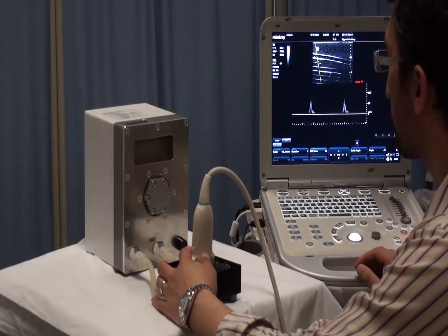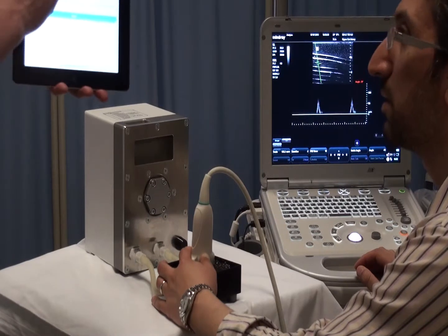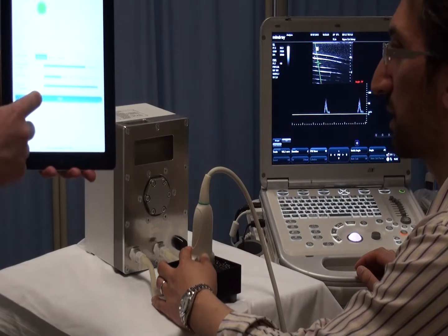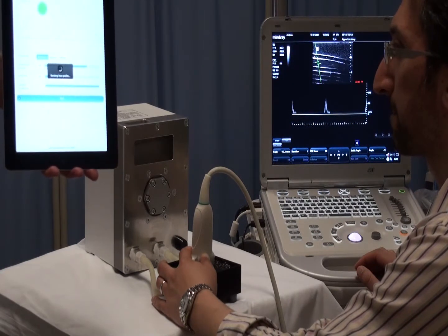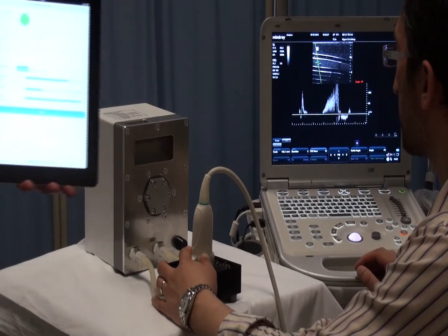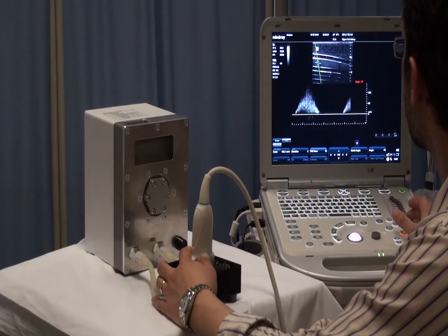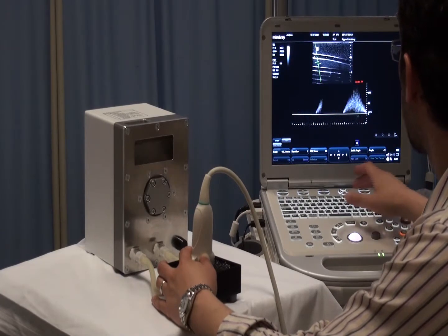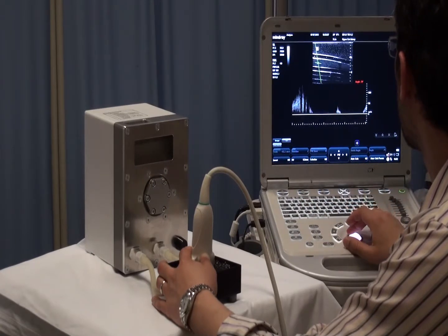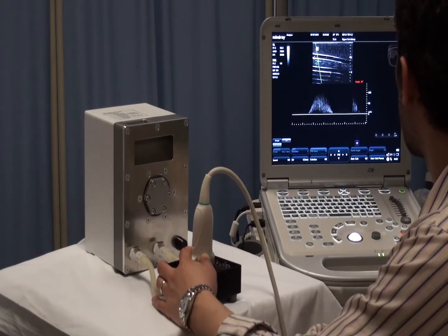Perhaps you can increase the spectral broadening a little bit, Nikolai. Oh, very good, that's pretty dramatic. Send that. Machine's resetting itself. Wow, that's a very good waveform indeed. I think we need to make that look a little bit more realistic by reducing the sample volume. And that is very interesting.